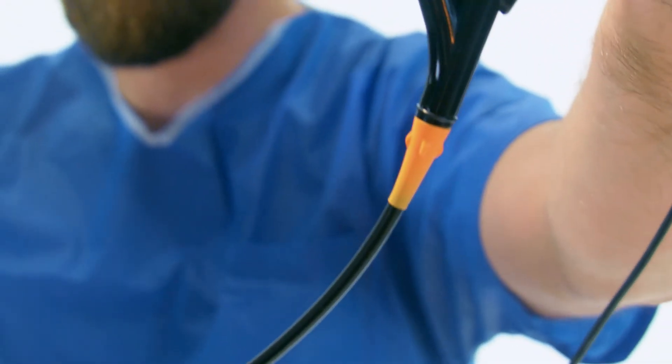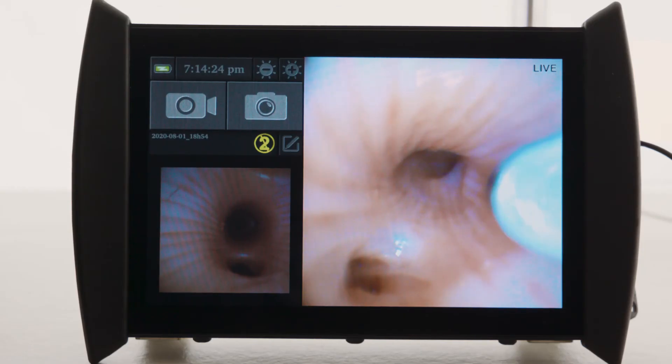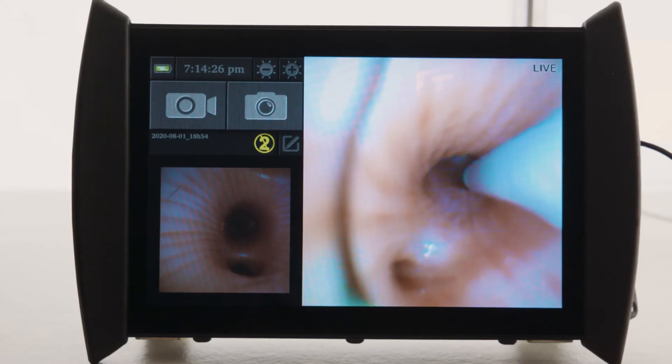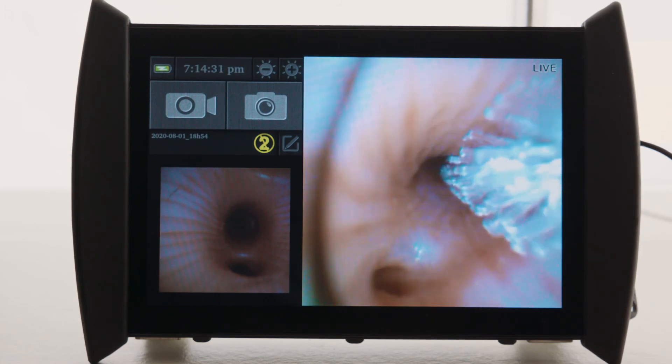The BroncoFlex Vortex can be used with a wide assortment of tools, such as forceps and brushes. Before using an accessory, its compatibility should always be verified and instructions for use consulted.